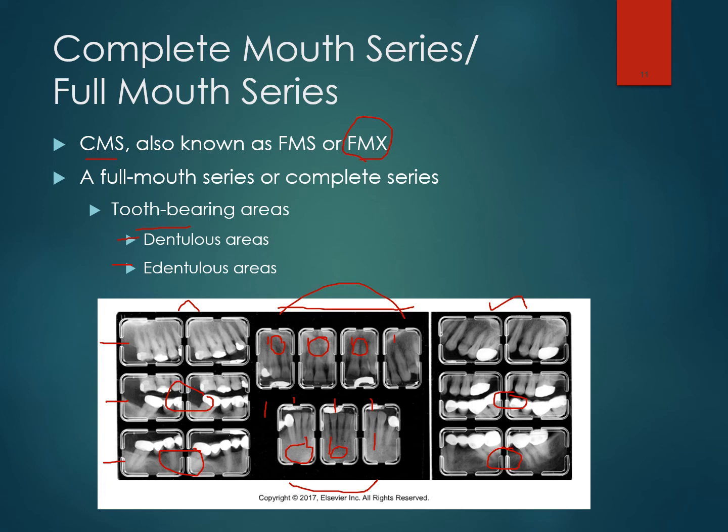It's uncomfortable for a patient, and that's important to know. It's important to have had one of these series taken on you before, because I want you to know what that feels like. It's not painful, but it's certainly not comfortable, and you need to be aware of that when you're doing this to your patients. Most of the time, they will take a full mouth series every 3 to 5 years.